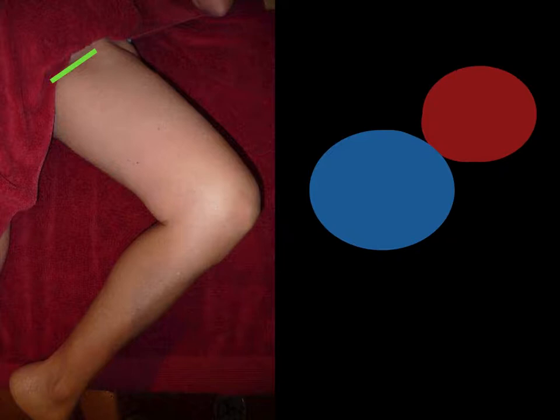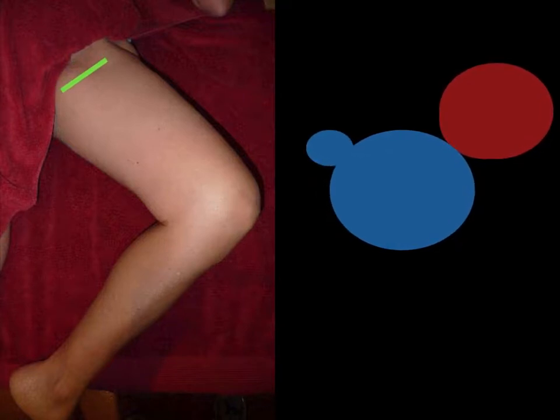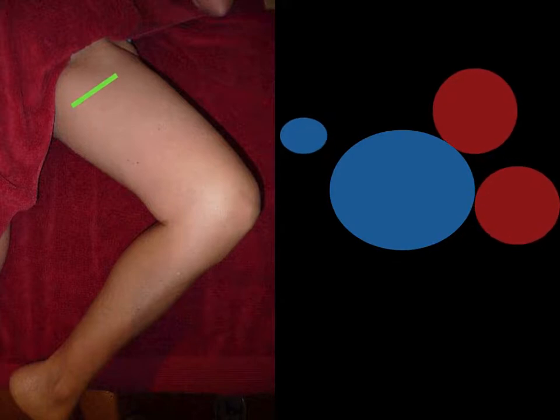Now, if we're right up high, just below the inguinal ligament, we should see the femoral vein medially and the femoral artery laterally. As we go a little more distally, we're going to see the greater saphenous vein come off of the common femoral vein medially. As we slide even more distally, that greater saphenous vein is going to move more medially, and the common femoral artery is going to bifurcate into the superficial femoral artery, which is in the near field, and the deep femoral artery, which is going to be in the far field.